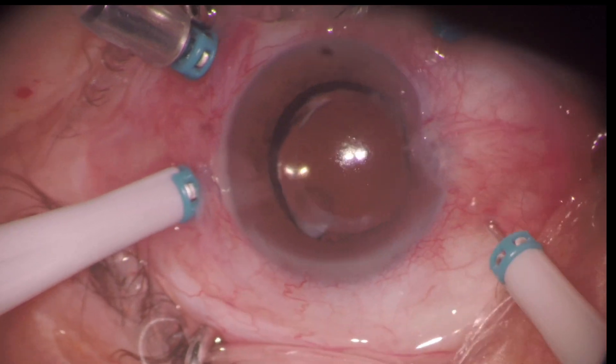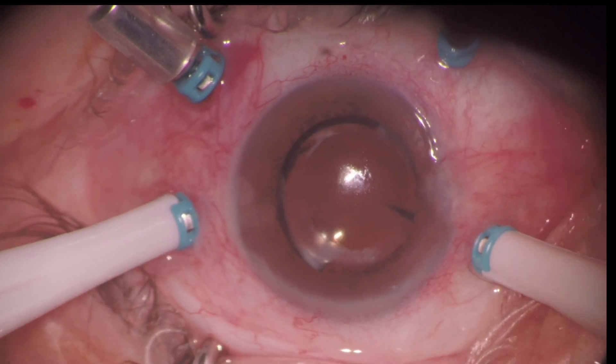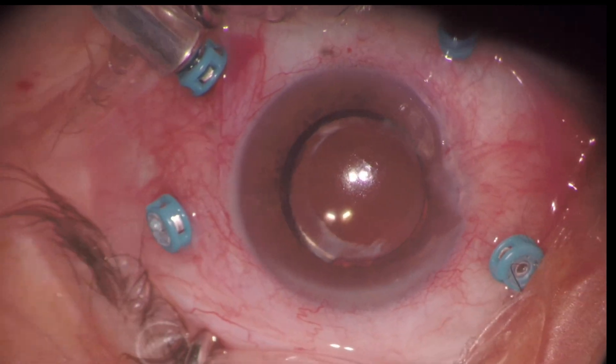In cases of vitreous hemorrhage, it's important to initiate core vitrectomy with good visualization of the vitrector tip. It's recommended that the surgeon does not move the instrument too much until the core vitrectomy allows better visualization of the posterior pole.